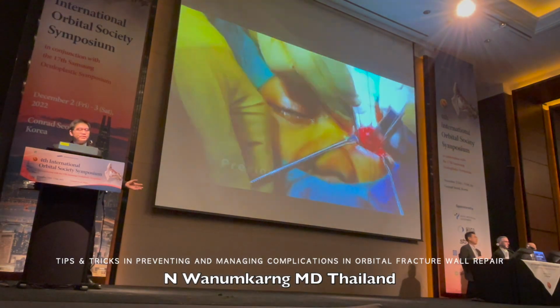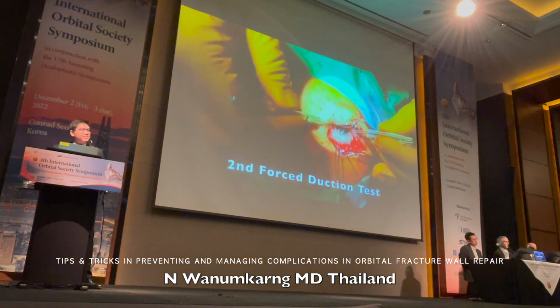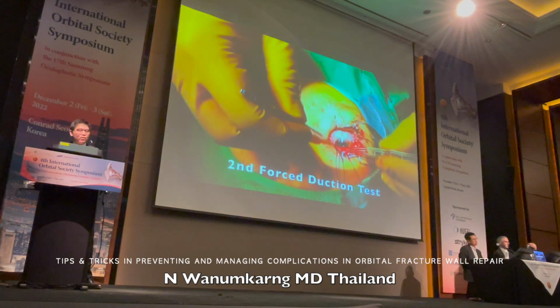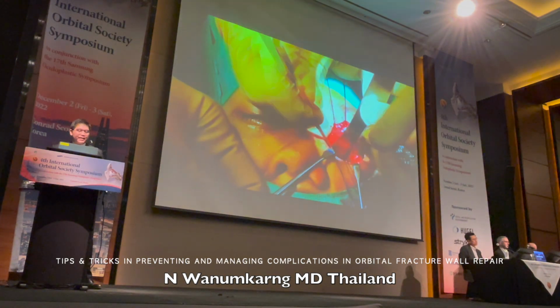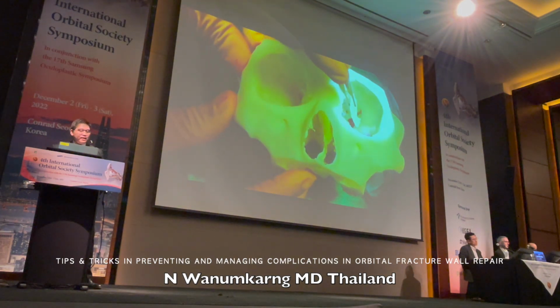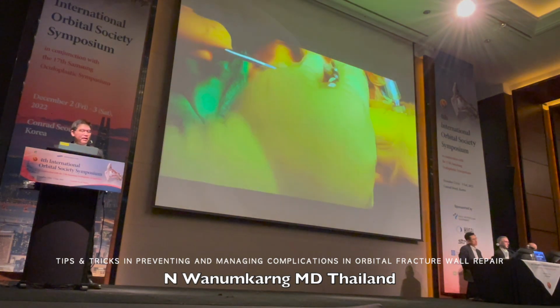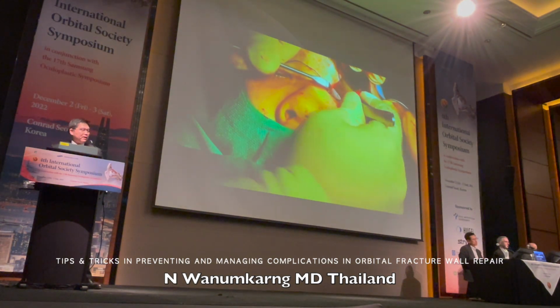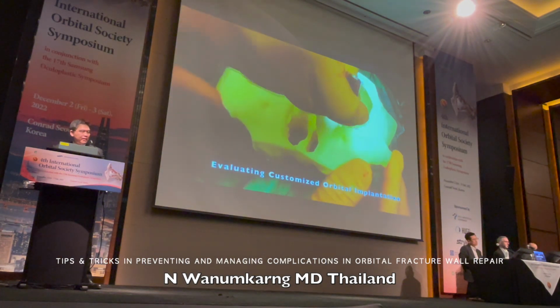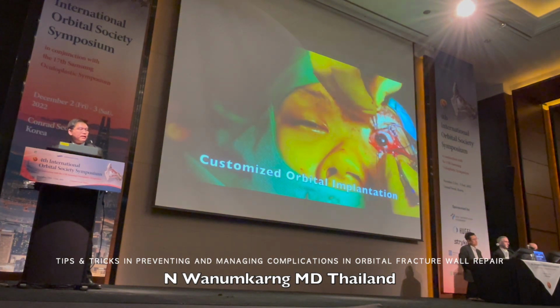You start on the normal side first and remember it, then you do it on the fracture side, and remember in your brain and hand memory how many percent of the resistance it is. When you remove the implant and reduce every bone and every restrictive tissue, before you put the implant in, it may be fully free for the duction test.